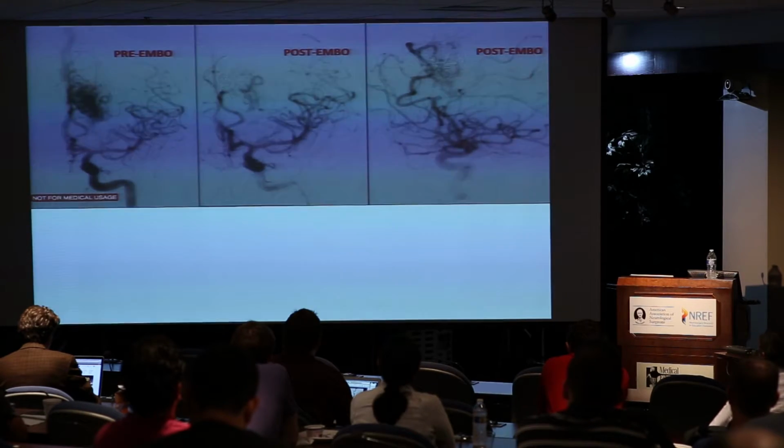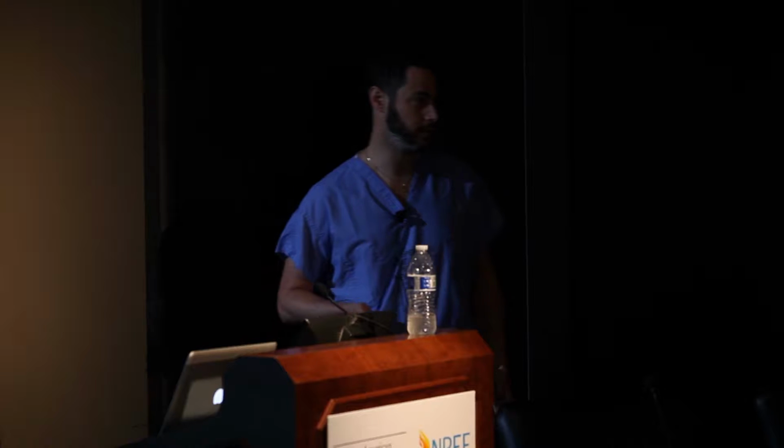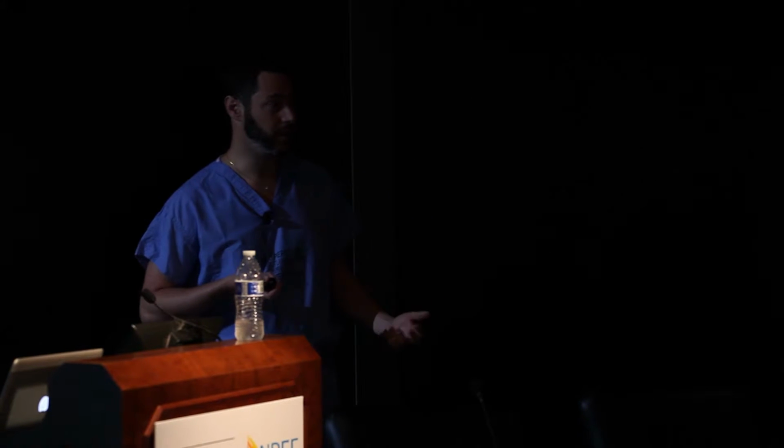You were looking at other places too. And look what's going on here. This is cut off. What the hell happened? That's our question for ourselves. What the hell happened, right? We got the catheter out. It's out. But there's a cutoff. Did the vessel dissect? Is it in spasm? Well, I don't know. I'm going to go find out now.